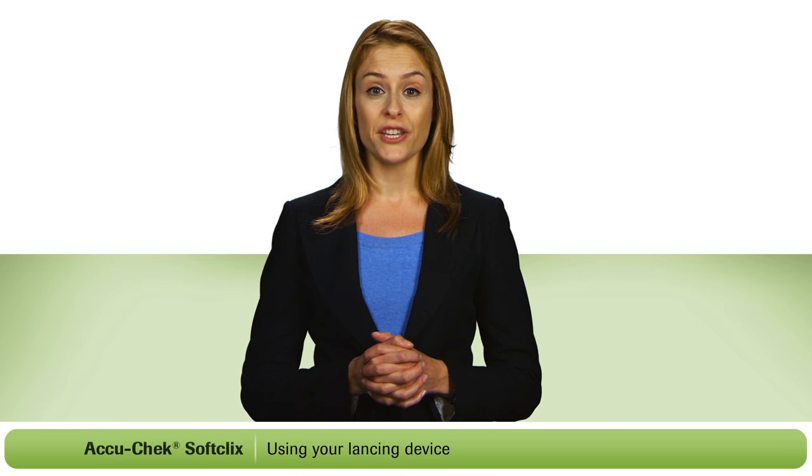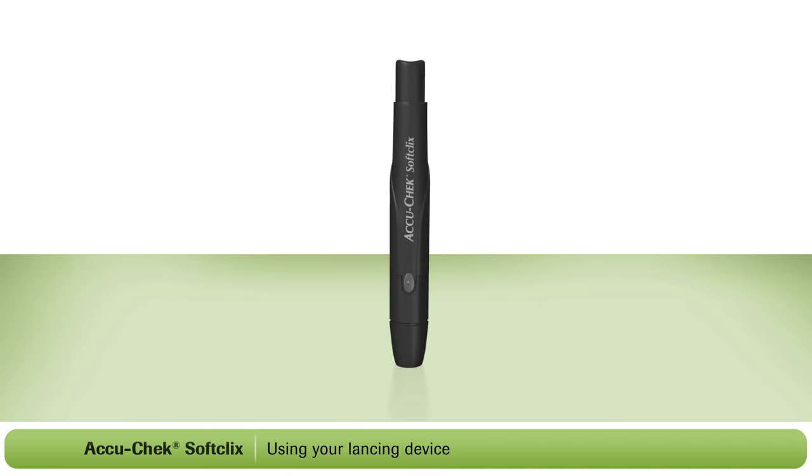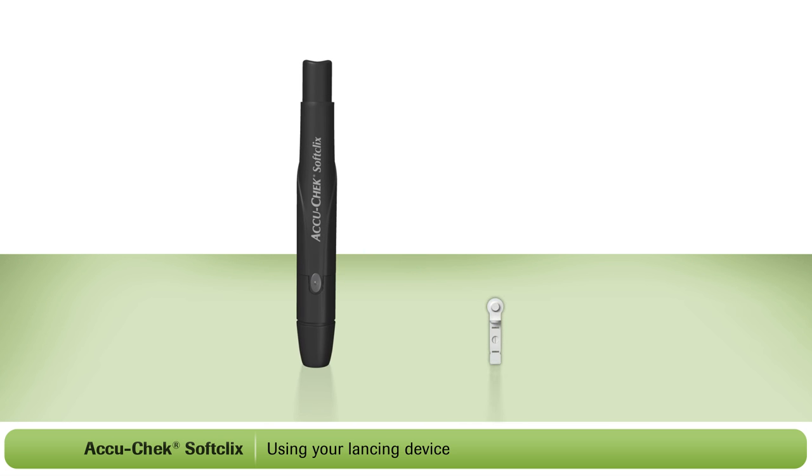I'm going to show you how to use the AccuCheck SoftClicks lancing device. First, you will need to load your lancing device. For this, you will need an AccuCheck SoftClicks lancet.